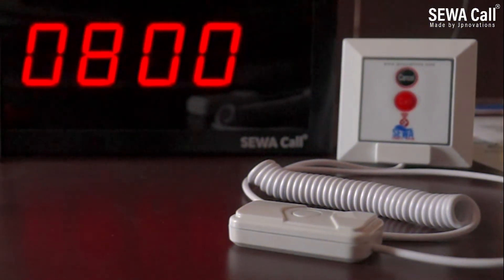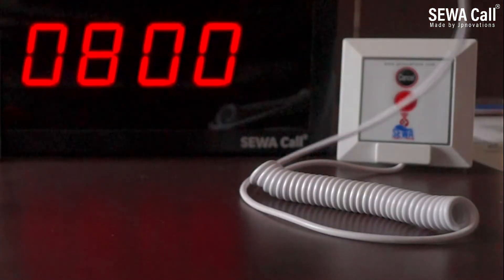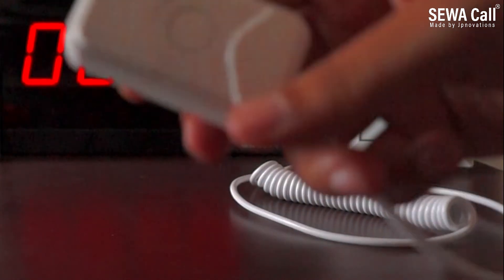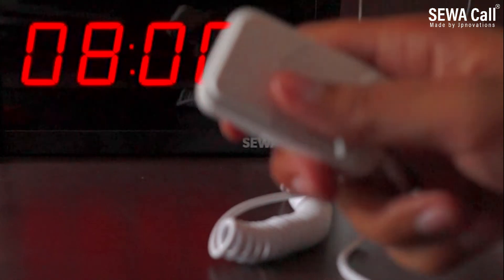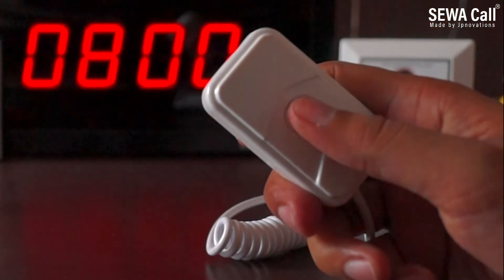This is the bed unit, which comes along with a 120 cm long flexible cord to ease the patient to make the call while laying down on the bed. As soon as the patient presses the call button, the bed or room number is displayed on the nurse panel.